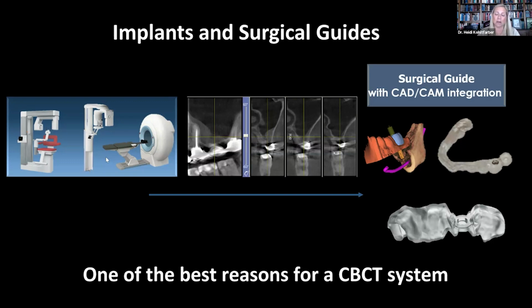We also did some of our research with third-year dental students. And we wanted to see the degree of accurate repeatability with using a surgical guide. And so you think about our third-year dental students, they're just getting up onto clinics. They're doing maybe the class 2s and class 3s. And we found that with a surgical guide, they were able to repeatedly, accurately place the implant within about 0.04 millimeters of the planned implant placement, which is phenomenal.